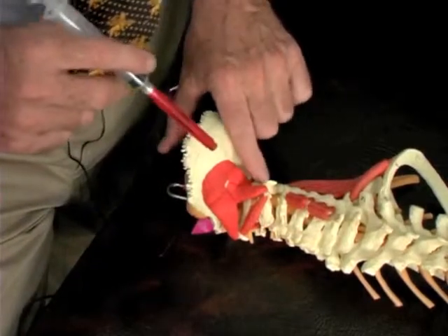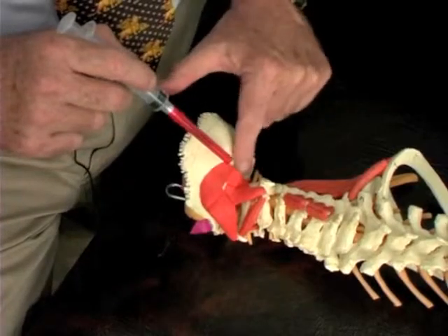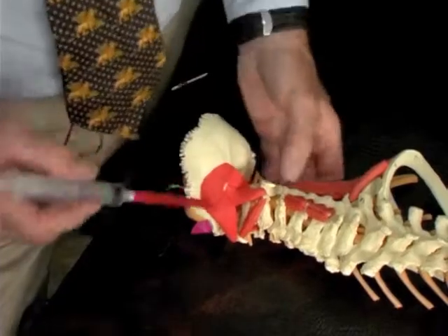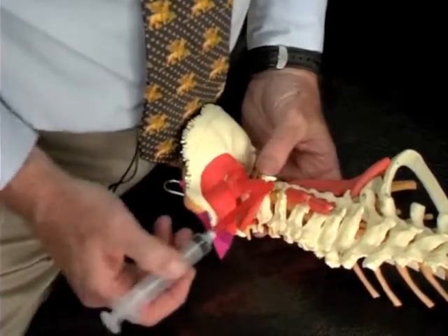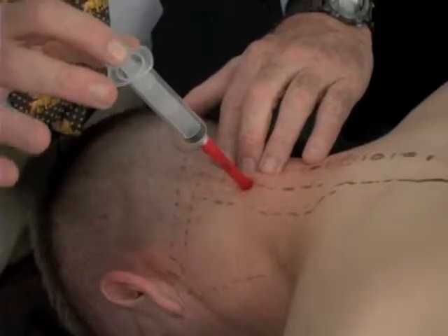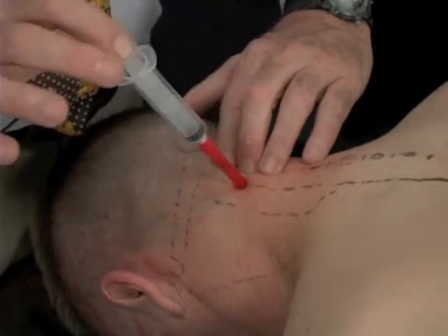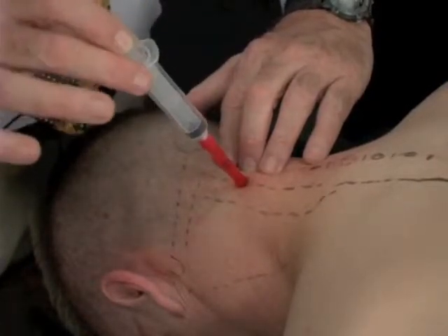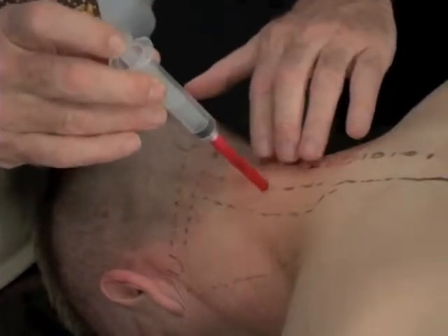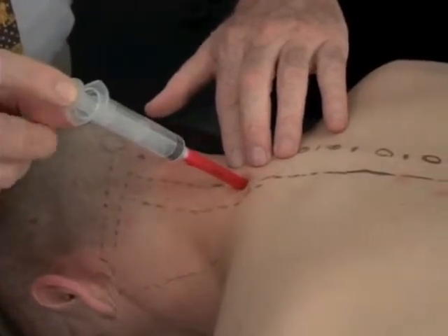We have identified our spinous processes and know that C2 is the first prominent one we should feel. There are a lot of attachments to C2, so with a little medial orientation — 20 or 30 degrees off of the midline — we inject there. Perpendicular would be straight in; about 30 degrees toward the midline is our target angle. We just walk down then with multiple injections, usually four or five in a row down this area.